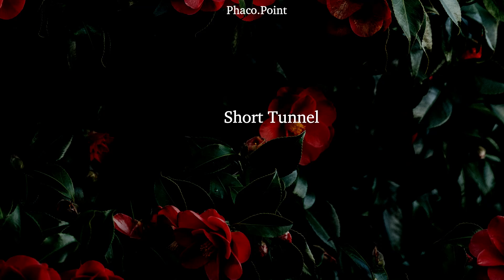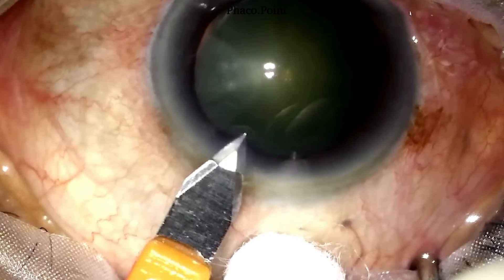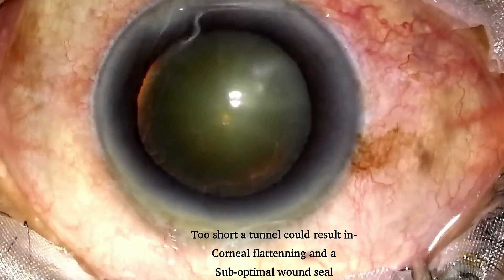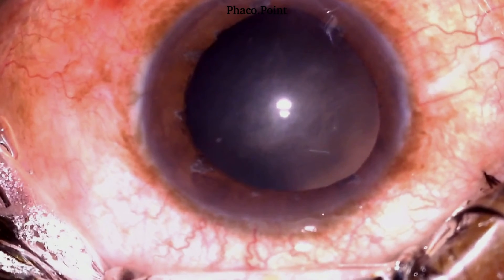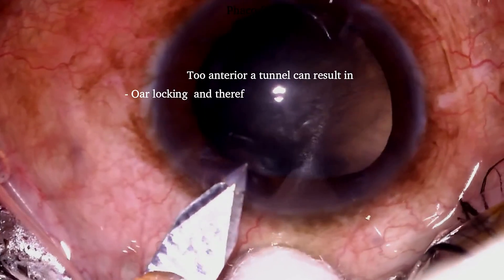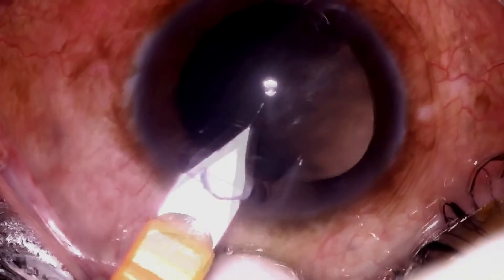How do you end up with a short tunnel? This happens if the length of your tunnel is too short — that is, you prematurely enter the anterior chamber, as demonstrated in this case. A tunnel which is very anteriorly placed, where the starting point of the tunnel is way into the cornea, is also not very ideal. Therefore, it is very important to pay meticulous attention to detail and notice the exact point on the cornea where the incision is initiated.